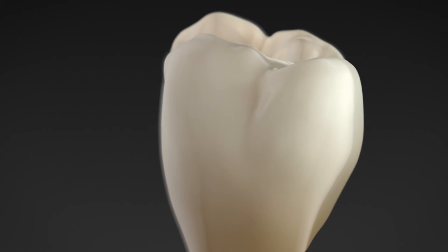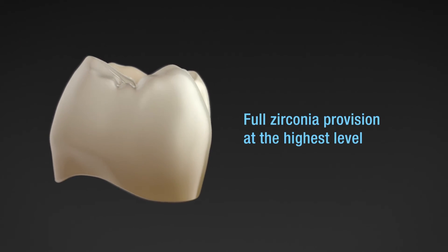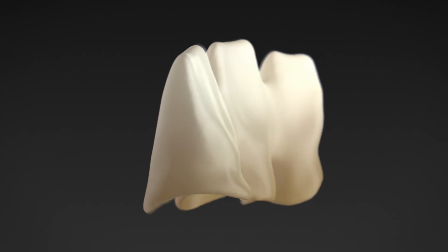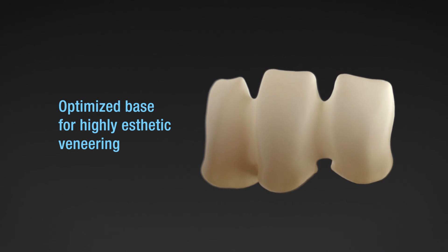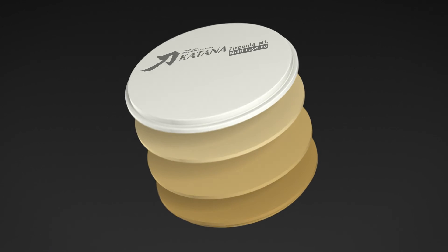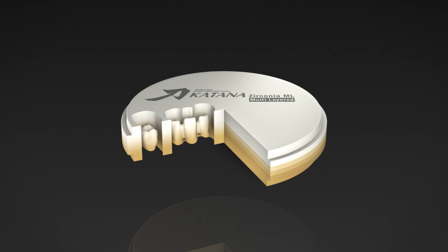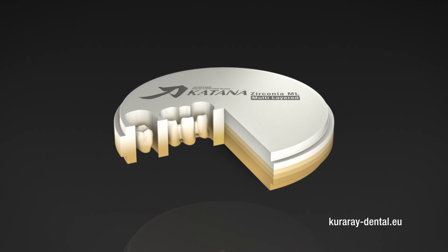The milled restorations can be polished or glazed directly after sintering — the simple and quick way to aesthetic results. In addition, the polychromatic zirconia frameworks are an ideal base for highly aesthetic veneering. Katana Zirconia ML polychromatic discs enable process reliability that has never been seen before: natural and predictable color results directly after milling. Katana Zirconia ML — zirconia discs with a natural tooth-shaded color gradient.